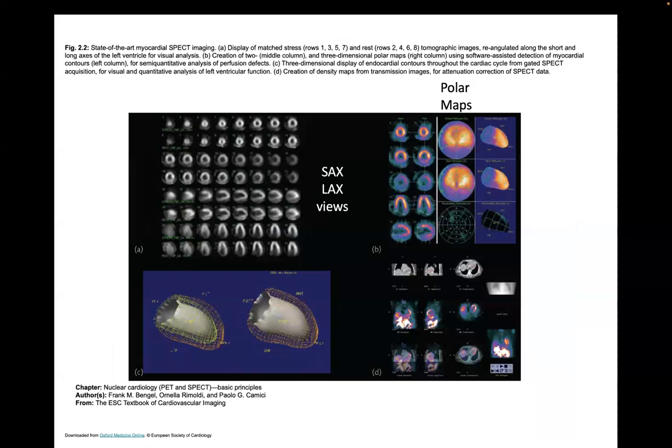And we'll get right to the heart, or what is created by this scanner, right off the bat here. This is a very busy slide, but we'll just walk through it carefully. These little donut shapes here are slices of the heart, of the left ventricle. So here's the left ventricle. This is a 3D model of the left ventricle, and on problem set 1, you guys created 2 types of left ventricle, one that was a cylinder and one that was a sphere. They're usually somewhere in between.